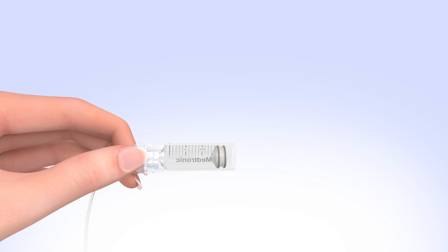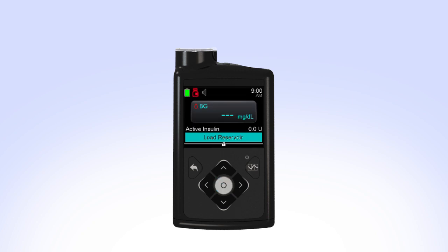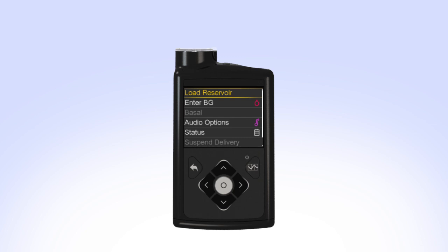Pick up the pump to review the next step on the screen. While you are filling your reservoir, the backlight may have turned off. Press the Select button to turn the screen on again. If the backlight has been off for a few minutes, your pump may have gone into sleep mode, locking the pump. If your pump is locked, press Select on the home screen. You will see the unlock screen. Press the arrow that is highlighted to unlock the pump and continue to the next screen.